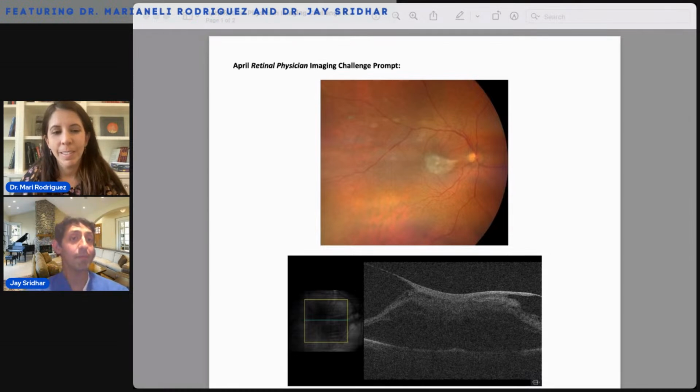But if there's a lamellar hole, I've actually switched. So I will not only leave air, I'll put an ILM flap over the lamellar defect and I'll put them face down. And I've had a couple of those. They look really good afterward. And maybe it's just lucky or anecdotal, but whatever. I'm just thinking, maybe if they have a little defect, you leave some sort of scaffold.